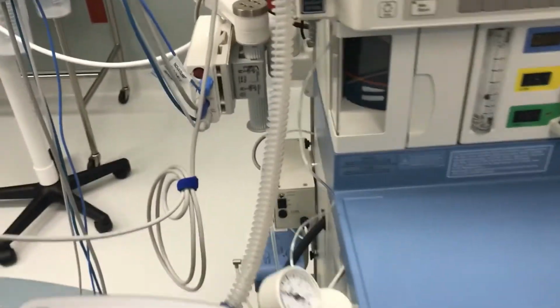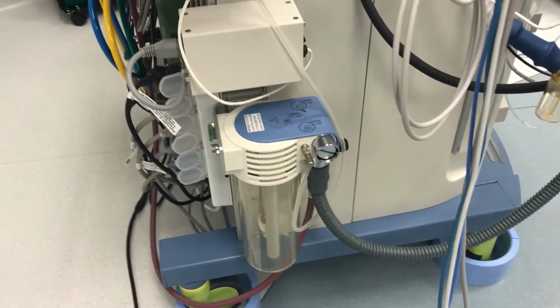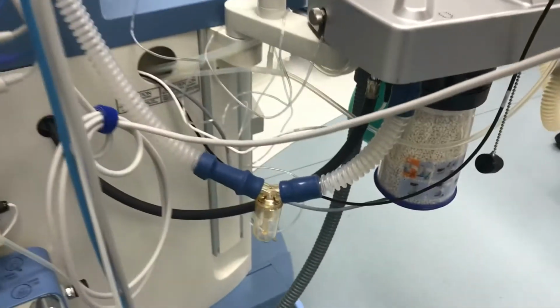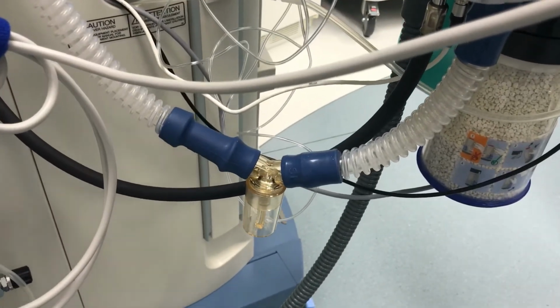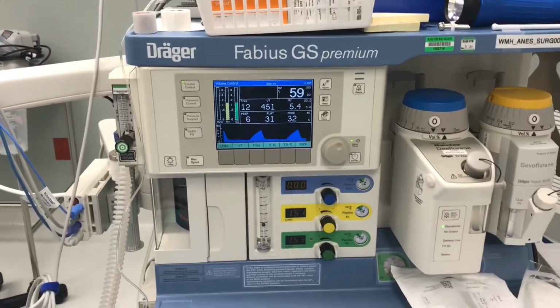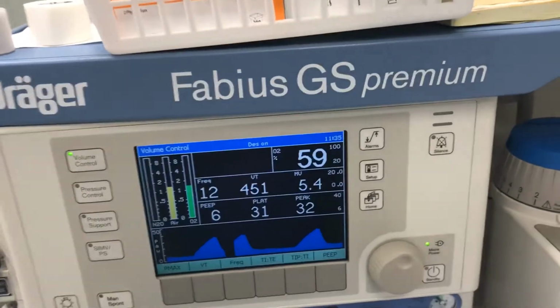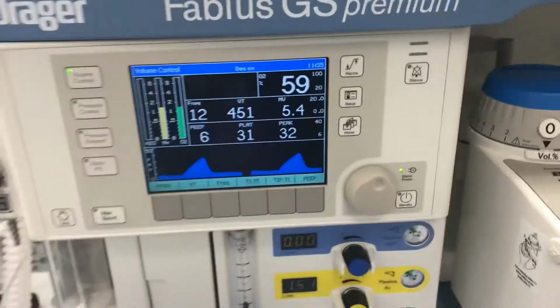It also has a scavenging system around on the side that has a drain at the bottom. This one has a drain catch going to the ventilator, so if we have excess condensation, we can take care of that way. Otherwise, the machines really work in a very similar pattern, where these are showing your actual displayed values versus your set values down here.